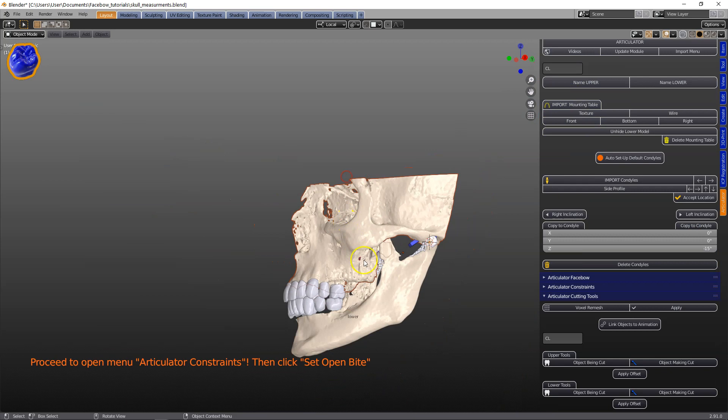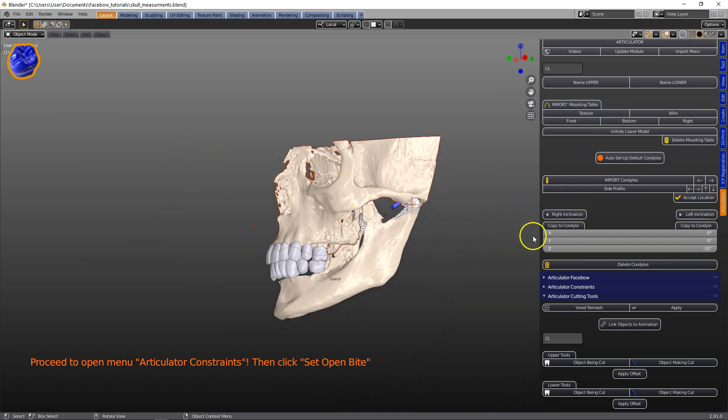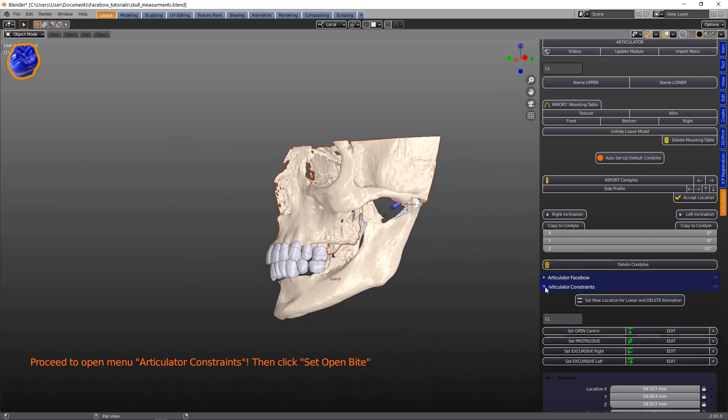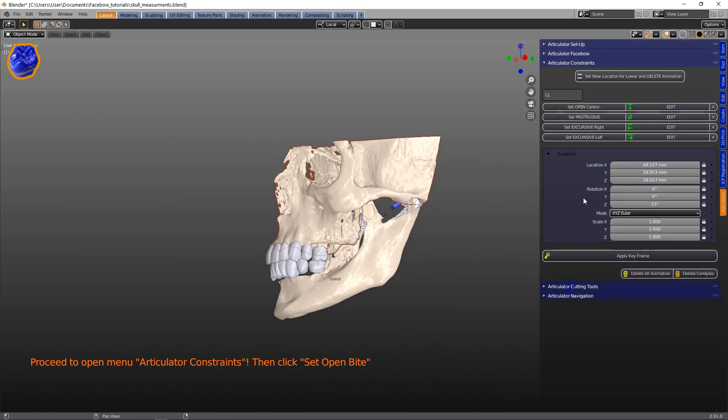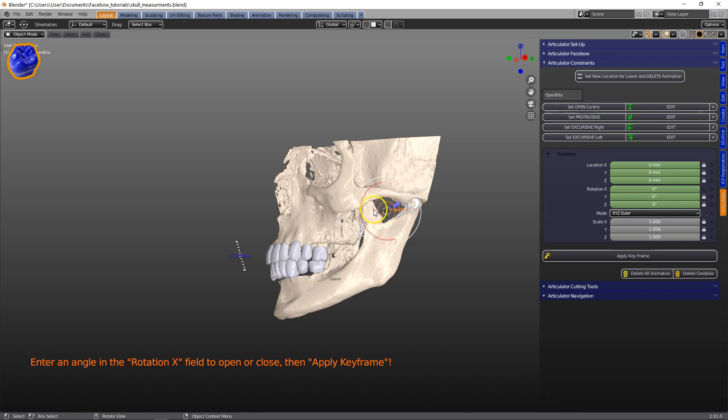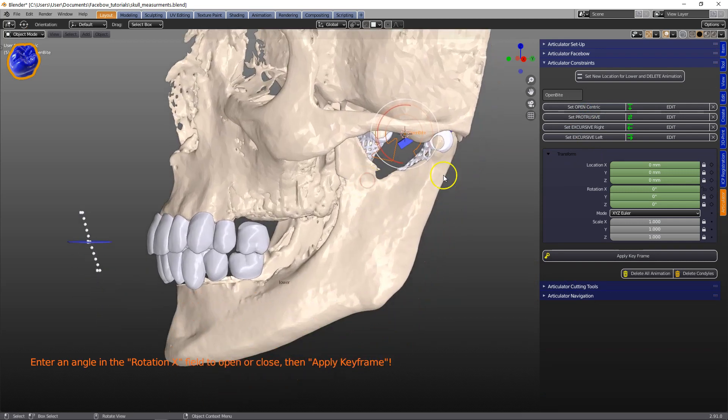Then we click on 'copy location' and the white TMJ object copies to it. So let us open up the constraints and animate the jaw.